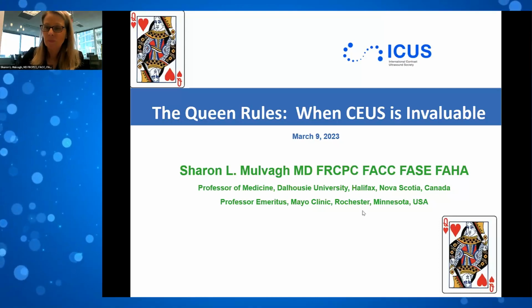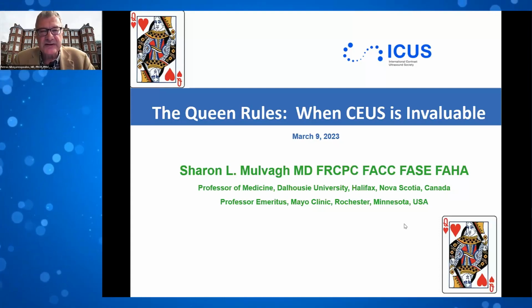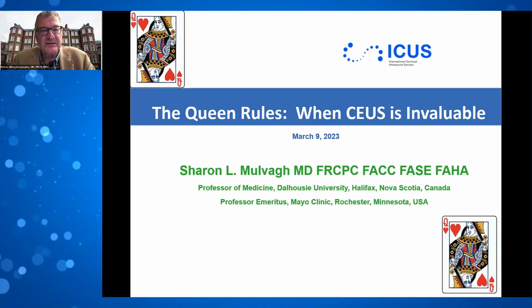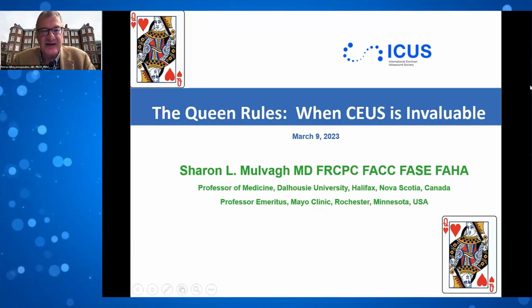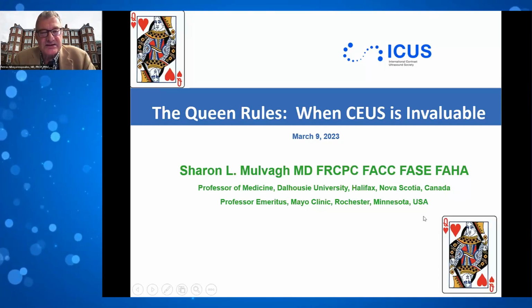But can I ask, you made such a convincing argument. Why do you think in the US there is still a rather low uptake of use of contrast in daily clinical practice in many labs? What are the main hurdles?